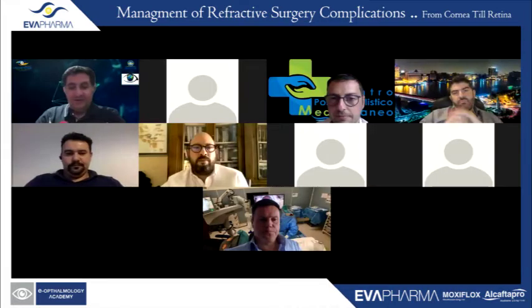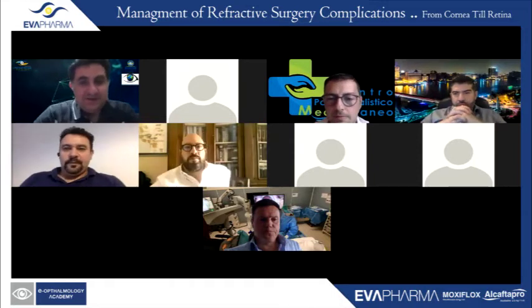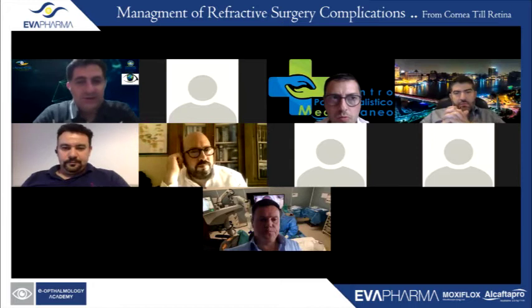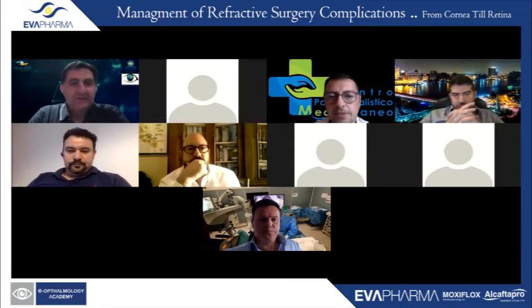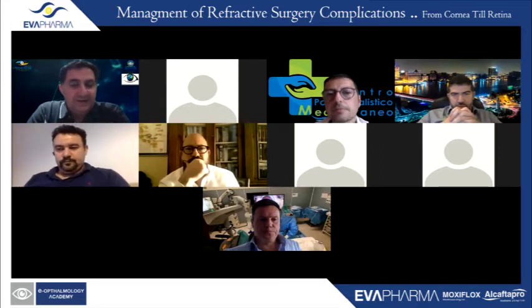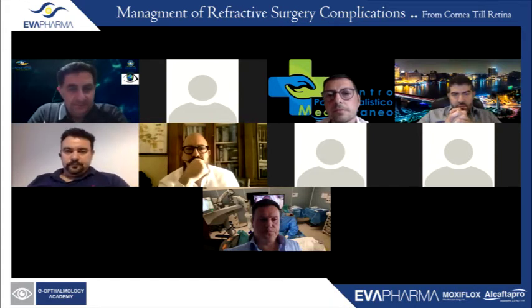Thank you, Miguel. It's a very nice illustrative presentation, but one of your cases I'm going to ask you about. It was an Acanthamoeba, and you did a manual removal of the epithelium, then you did a dry PTK twice. You don't fear that the infection can flare up with the laser beams?